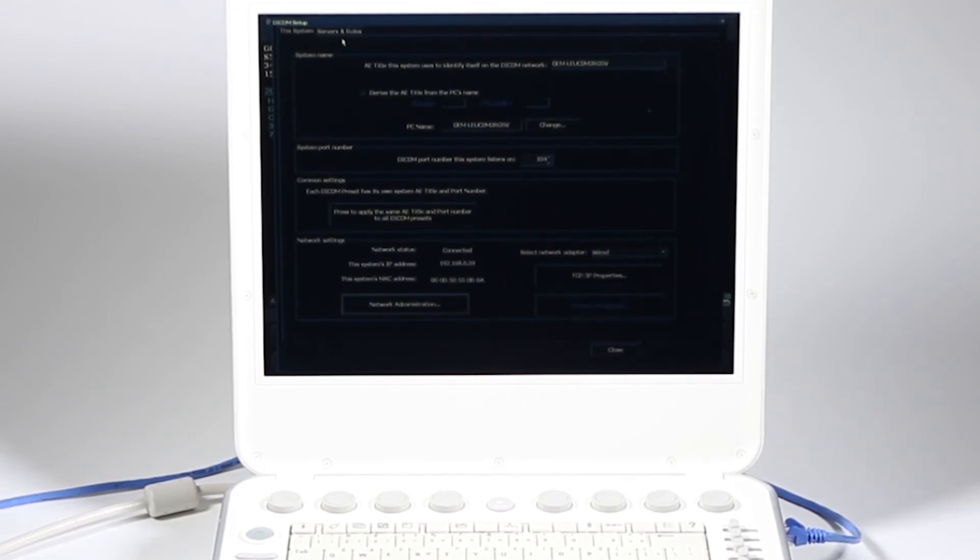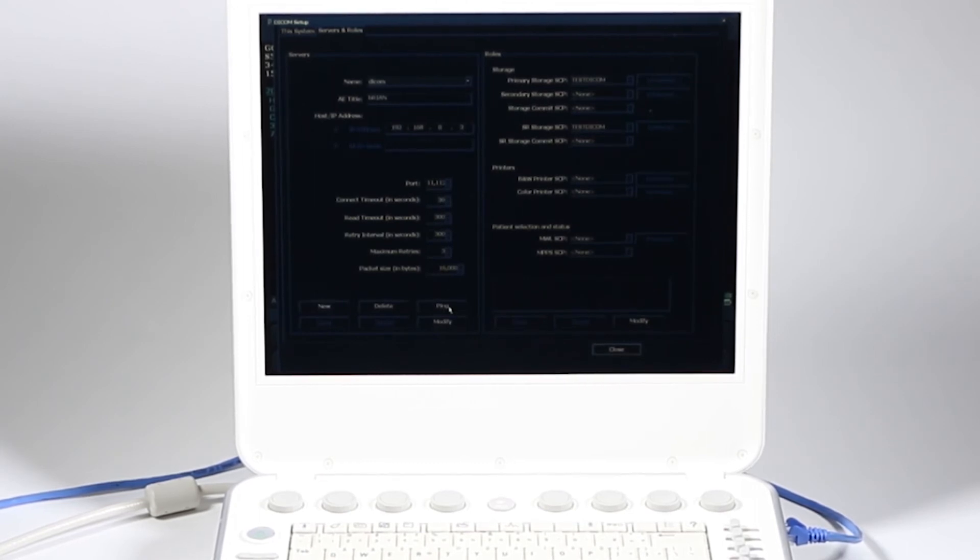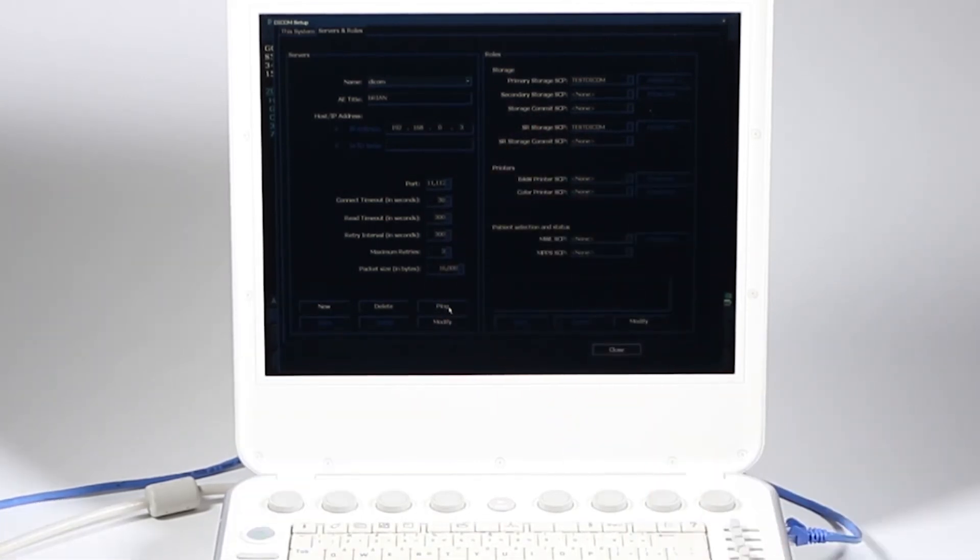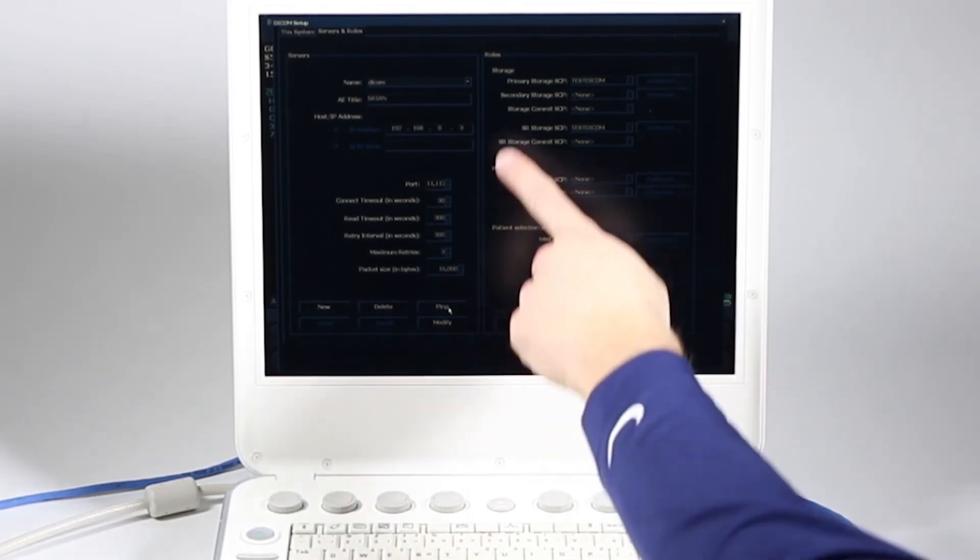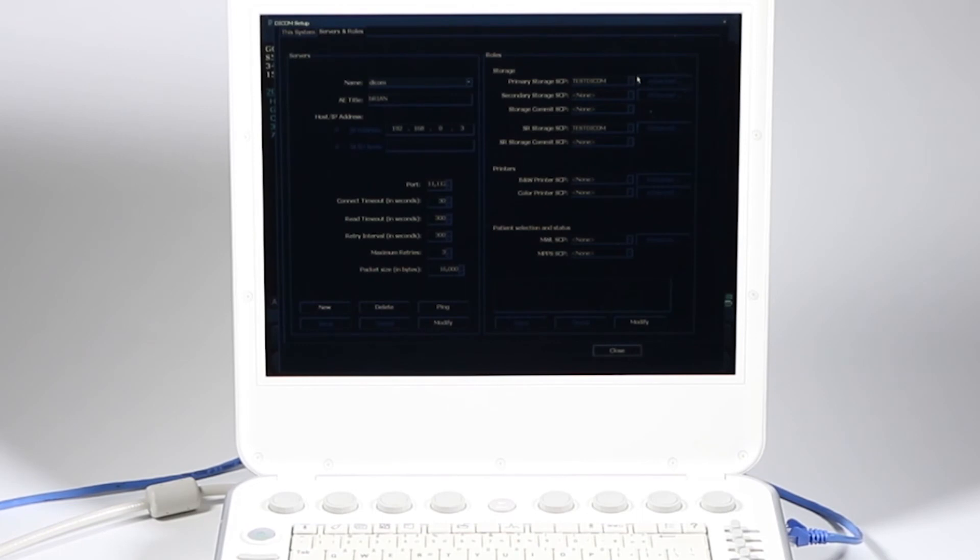I'm going to close there. And then again, go up to my servers and roles. This ping is checking. The first ping was saying, am I on the network? The second one, this one here says, can I talk to that machine over there? The DICOM server said, yep, you're all set.